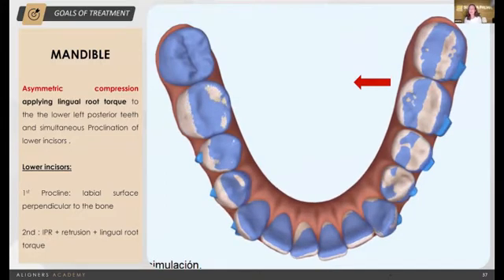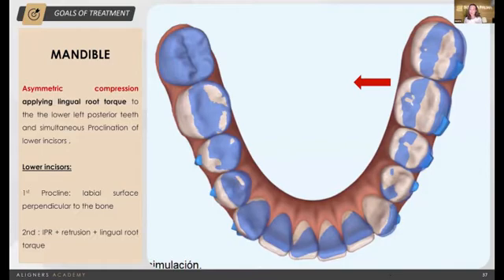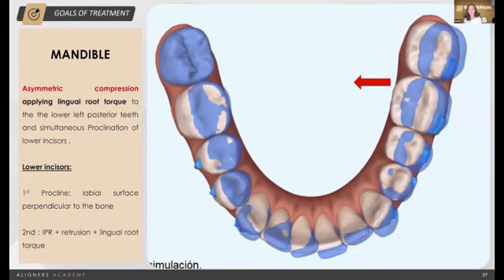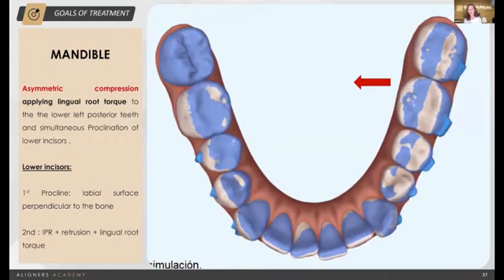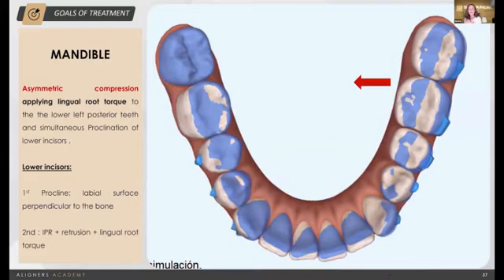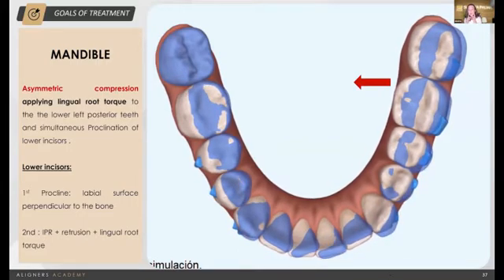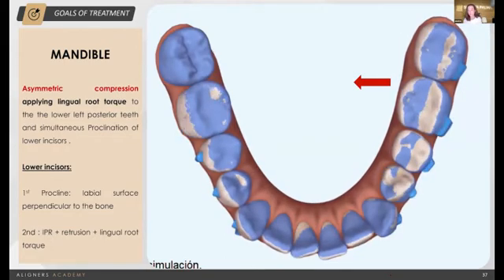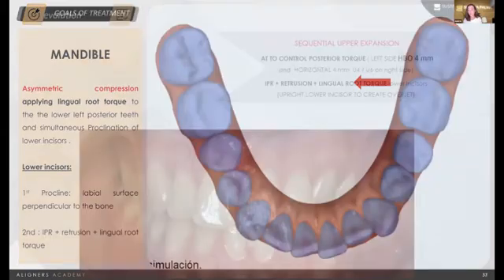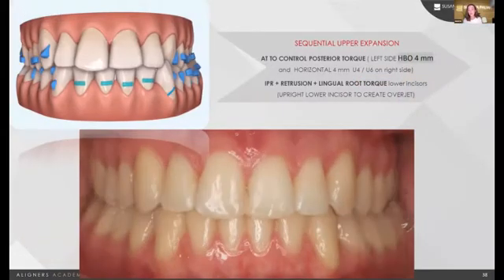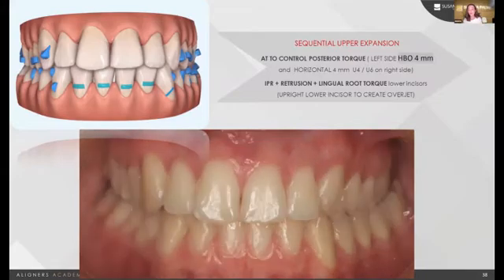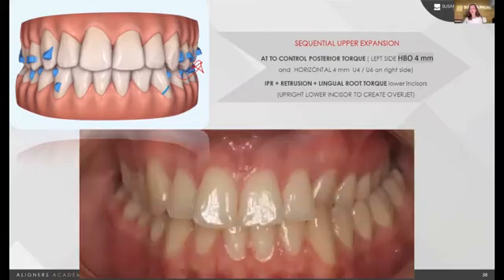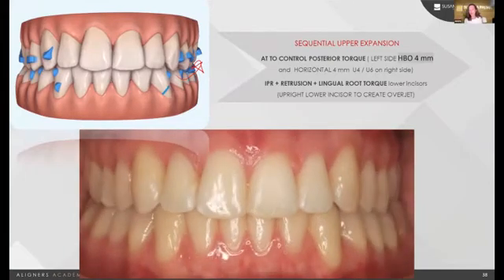Also remember that every time we are expanding the upper arch, we are going to have a simultaneous retraction of the upper incisor, even though we don't always see this effect in our Clincheck. So in order to prevent anterior interferences at the end of treatment that create a posterior open bite, we will have to reduce the lower incisor during treatment. We can see here how we make the corrections — the expansion — checking that we are asking for expansion and changing the torque, asking for labial root torque during the expansion in the upper arch.